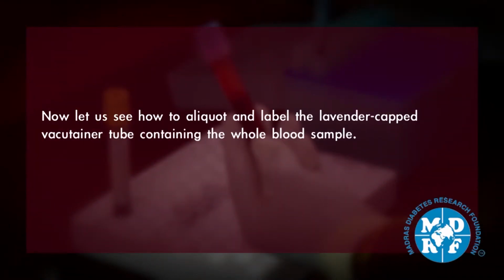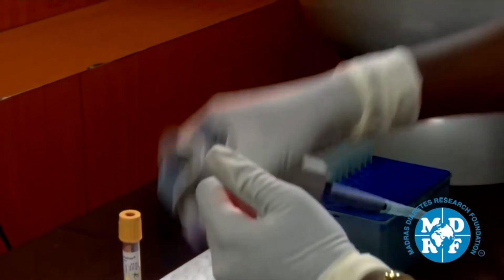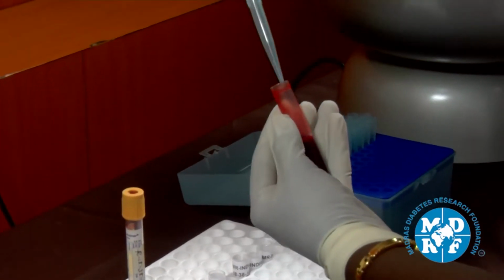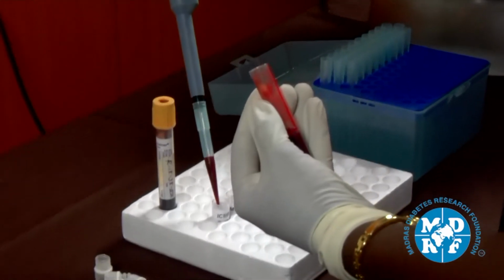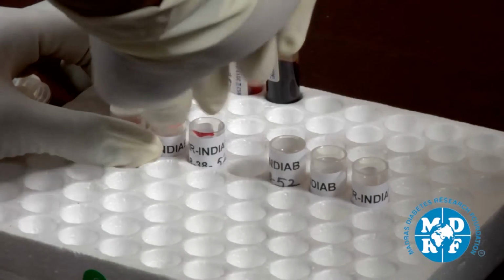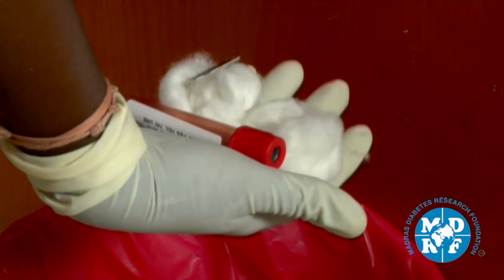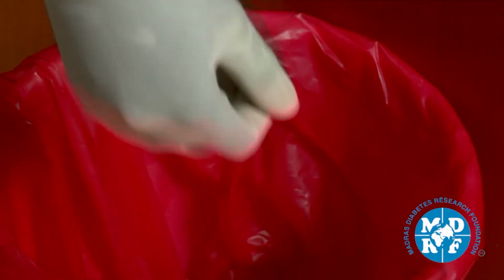Now let us see how to aliquot and label the lavender-capped vacutainer tube containing the whole blood sample. The lavender tube has to be uncapped and aliquoted into 3 1.2 ml cryo vials with the help of a micropipette. Screw the caps securely onto the cryo vials and store them into the cryo box provided for them. Recap the used vacutainers and discard them into the bag provided for biological waste.